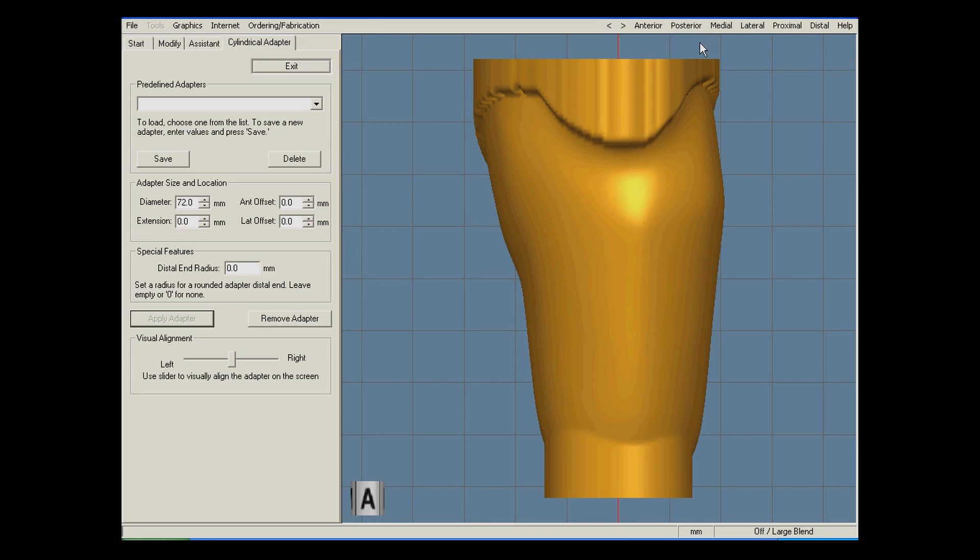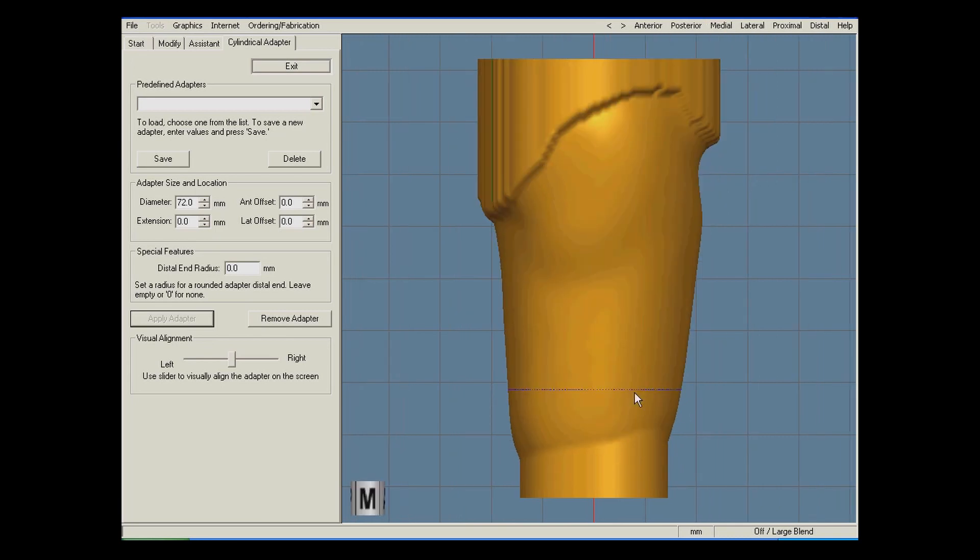From the anterior view, I can see that the lateral side of the socket slightly overhangs the adapter. And then from the medial view, I can see that the socket is a little too far back and needs shifted forward slightly.